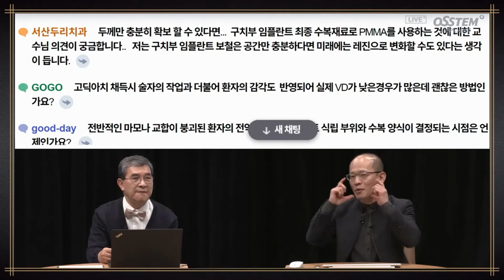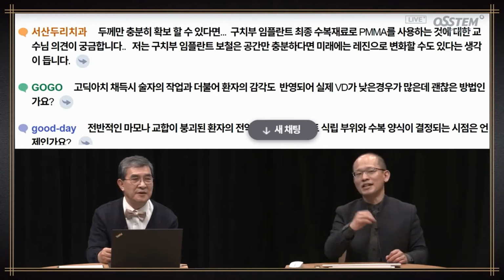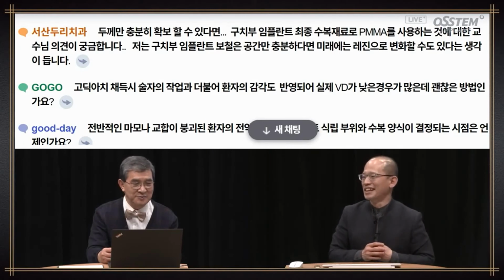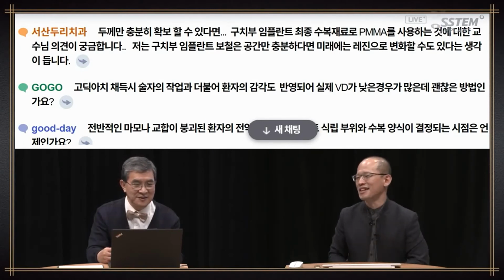So the VD, when you have measurement, when the mouth is closed, you check that. So in the closing path of the patient, whether it's vertical, needs to be checked. So you need to check that. Besides that, well, the patient sensitivity. So patients prefer actually lower VD than higher VD. Yes, that is correct. So two conditions need to be thought about.